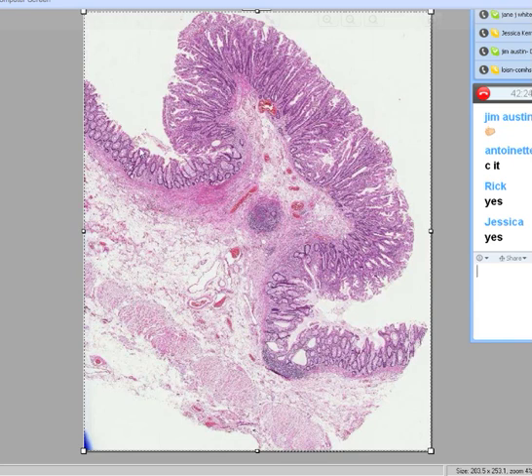So the whole West Coast, all of California, is your classical large bowel. Now, what do we really have here? What it looks like we have here is a projection of the submucosa into a polypoid structure. And if you agree that it looks polypoid and it's a projection, then you already have the name of the diagnosis. It's a polyp.